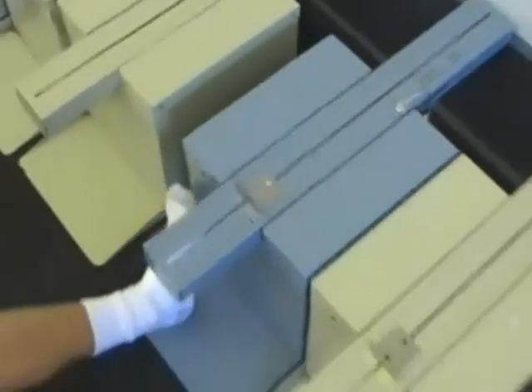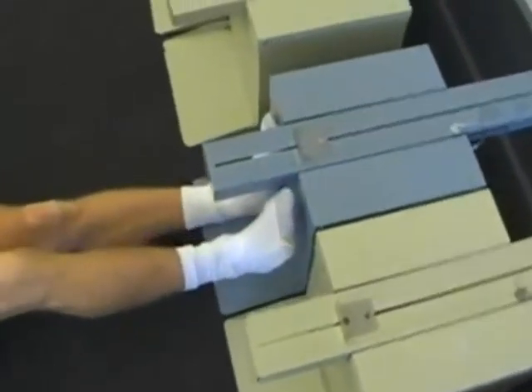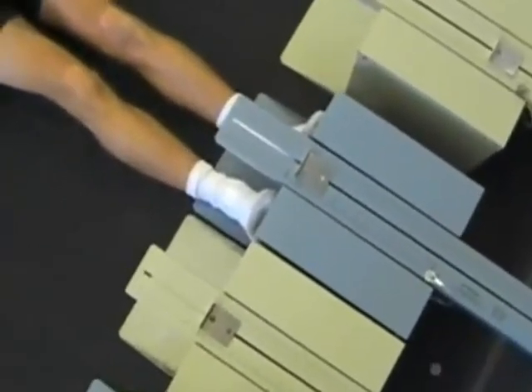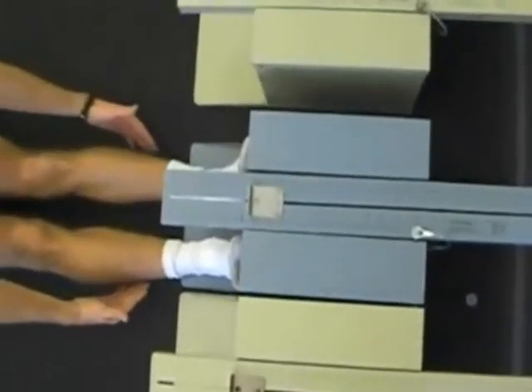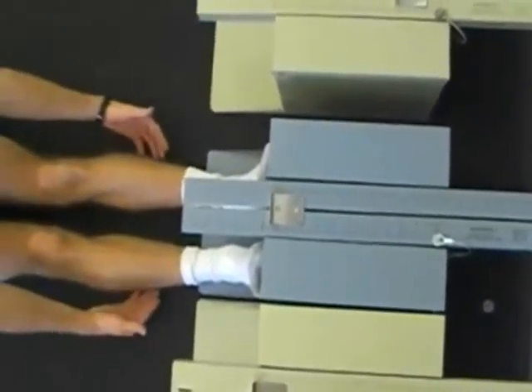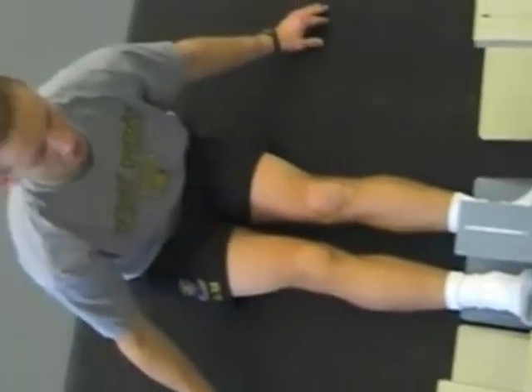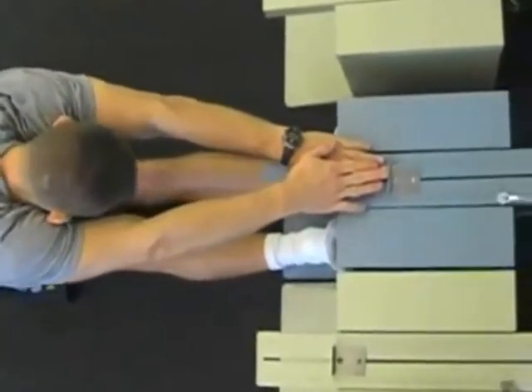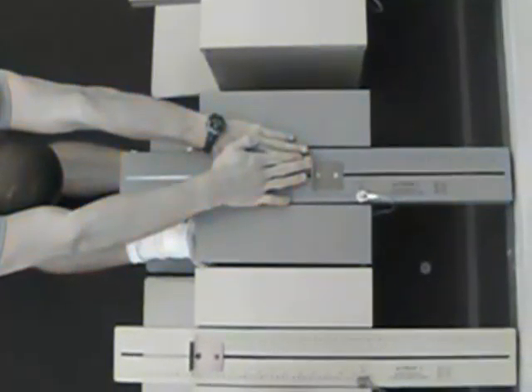Collect your data by reading the centimeter scale on the far right side of the equipment. Ensure that 23 centimeters is at the end of your feet, so stretching one centimeter past your toes is recorded as 24 centimeters. Slowly reach forward with both hands as far as possible and hold your final position for a few seconds.